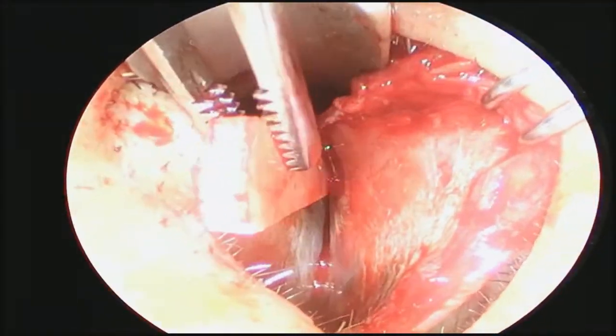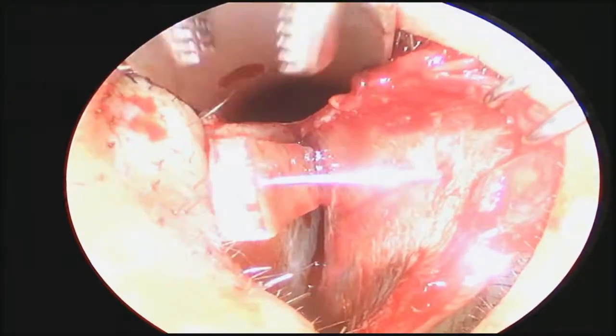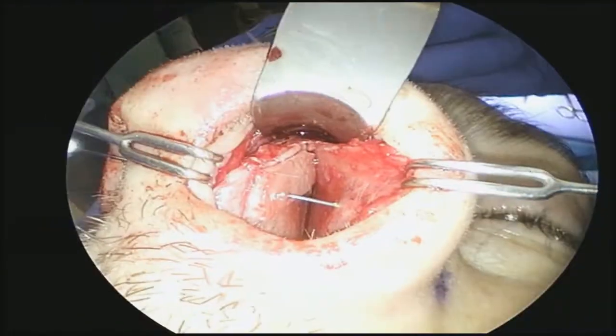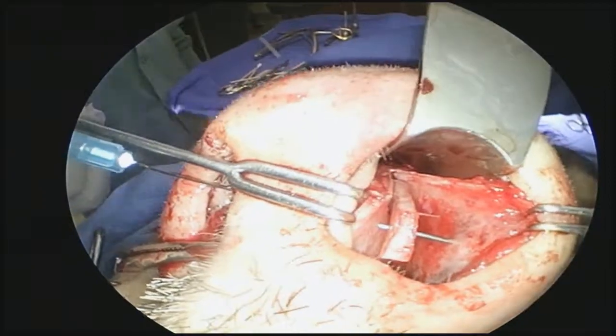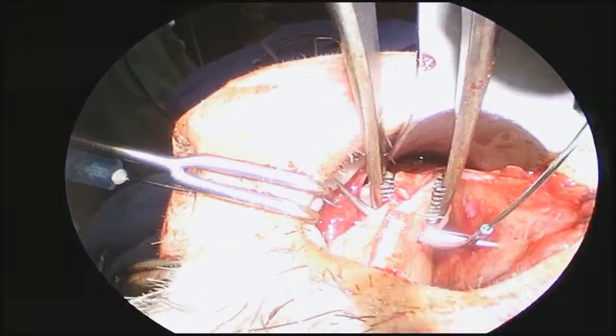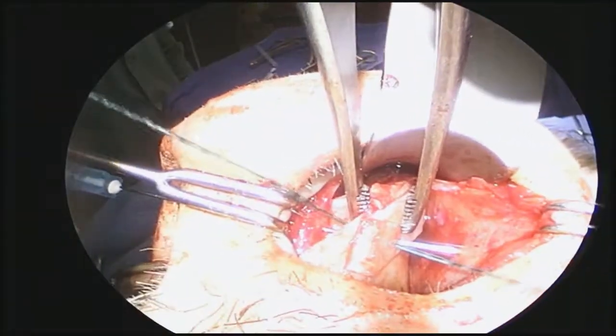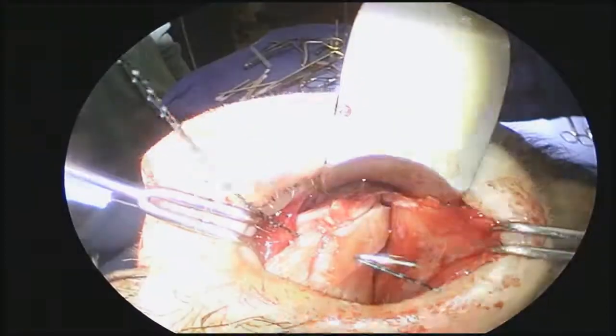The left spreader graft is temporarily secured to the cartilaginous septum with a hollow bore needle. A running horizontal mattress technique is used to secure the graft to the septum with a knotless barbed suture.